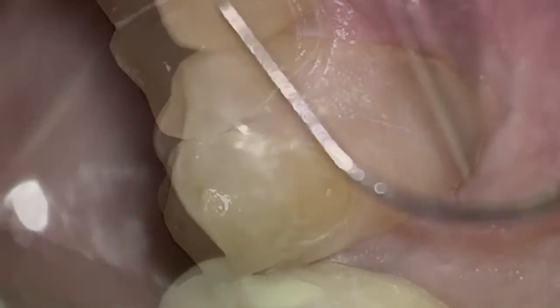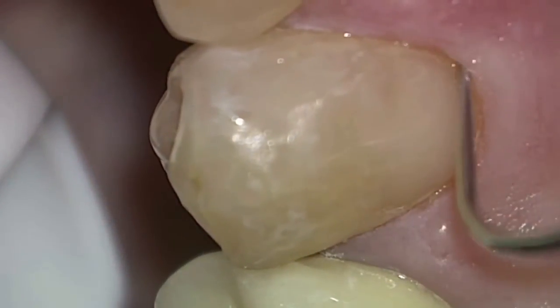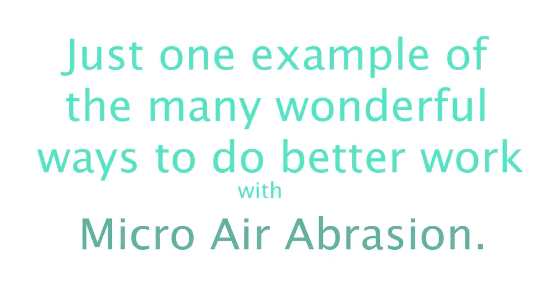So we can do a beautiful bonding that adheres perfectly to the well-cleaned tooth. You can look through some of my other videos and you will see the air abrasion unit featured. There are so many uses for it and it makes me a better dentist.